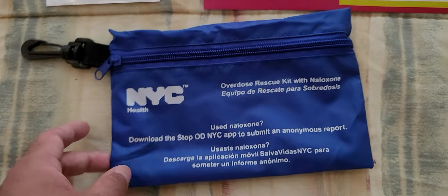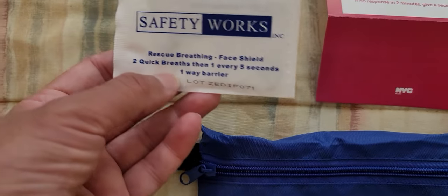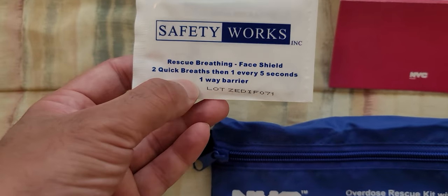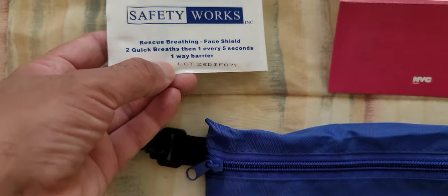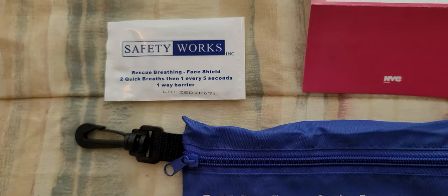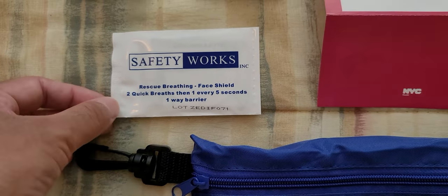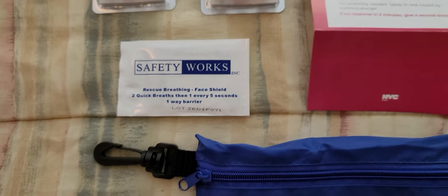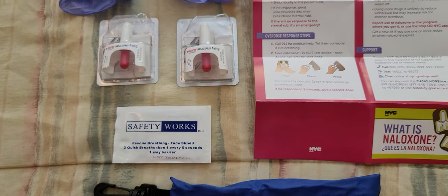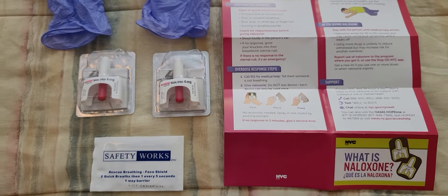This here is a rescue breathing face shield. It says two quick breaths, then one every five seconds — one-way barrier. You place that on the person's face to protect yourself while you help them. You have to do this quickly because you don't have many minutes to save this person.